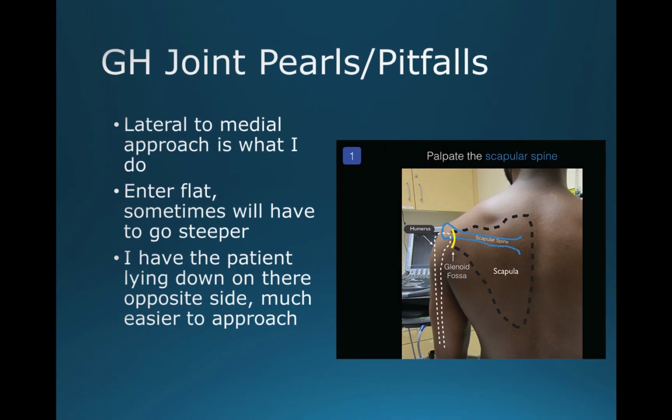Glenohumeral joint pearls and pitfalls. Lateral to medial approach is what I will typically do. You want to enter flat. Sometimes you'll have to go steeper. I have the patient lying down on their opposite side, which is a much easier way to approach.